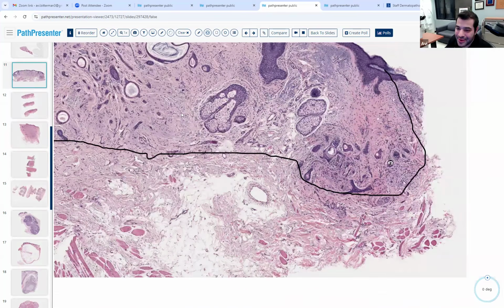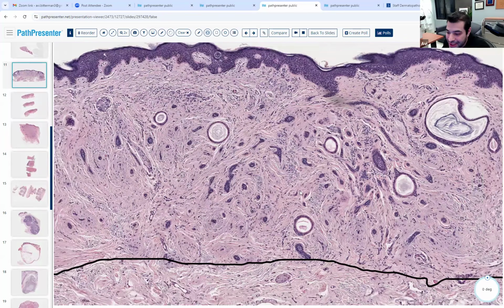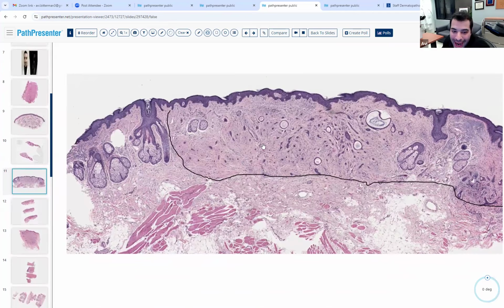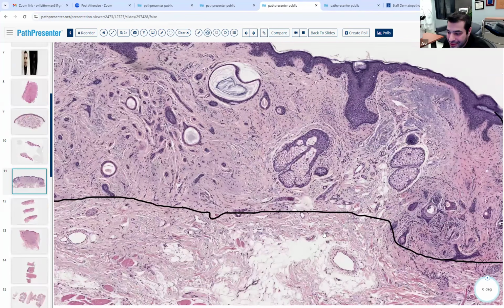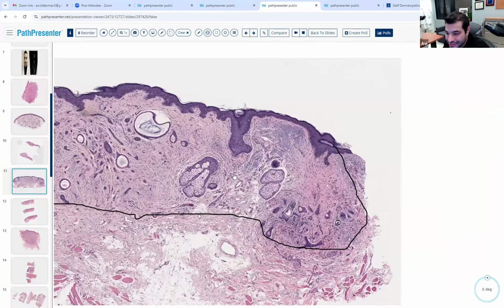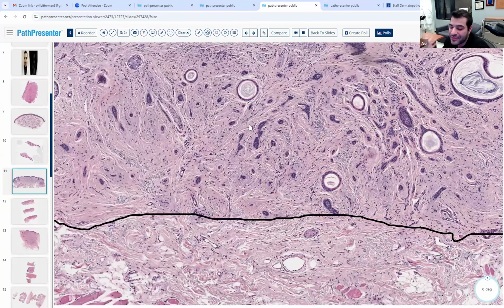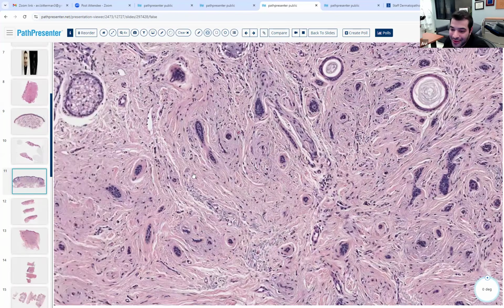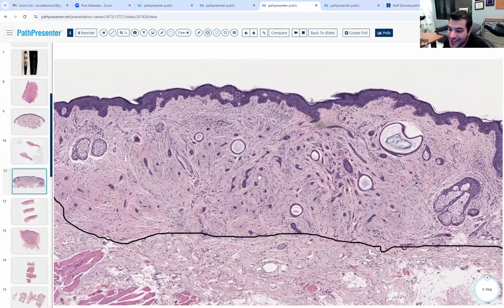It looks like it has this infiltrating pattern because it's in the Paisley tie differential, but it's not infiltrating the way our MAC was or the way our other malignant neoplasms were. In fact, from low power, you can delineate where this is. It's fairly large, I'm not going to lie, but it is circumscribed. And that, along with the calcification and the pseudohorn cyst, and we have some that some might describe as desmoplasia.